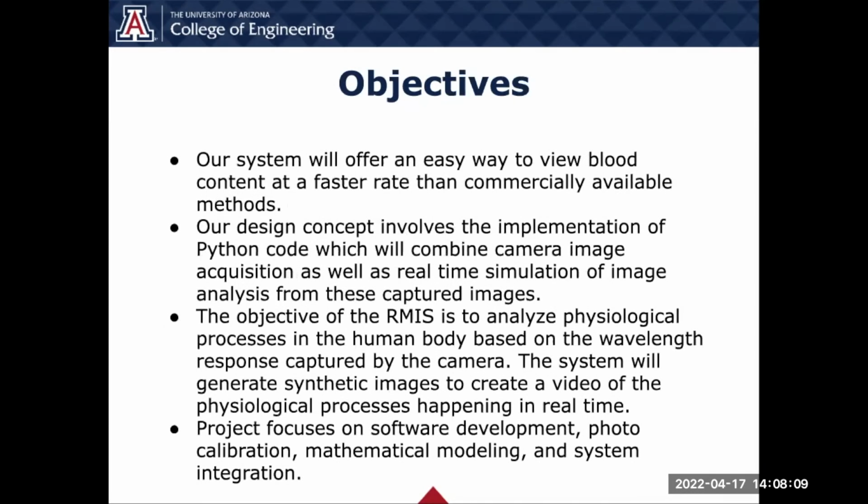So the objectives of our system will offer an easy way to view blood content at a faster rate than commercially available methods. Our design concept involves the implementation of Python coding, which combines camera image acquisition data as well as real-time simulation of image analysis from these captured images.